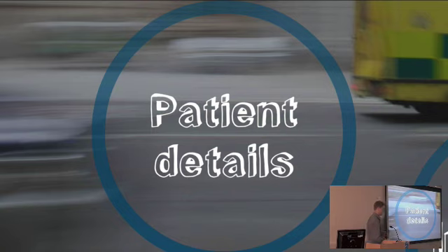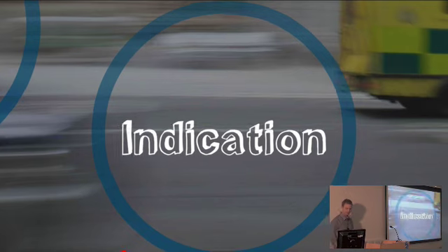So obviously, the first thing that you're going to do when you're asked to present an ECG in an OSCE is to tell who the patient is. So I'm checking the patient. This is John Smith, date of birth, 1st of the 1st, 1910. It shows that you've checked that it's the right ECG.